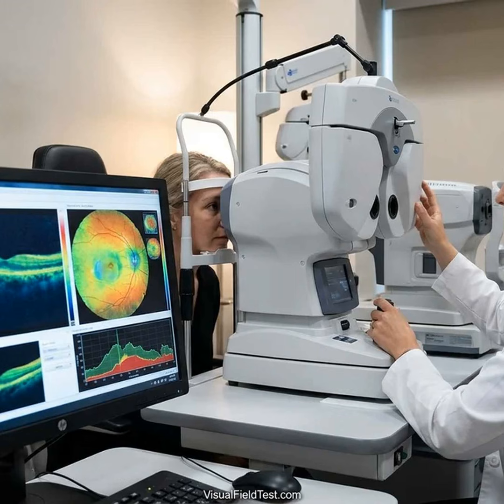One key tool is Optical Coherence Tomography, OCT. OCT is a non-invasive imaging scan that uses light to make cross-section pictures of the retina, the light-sensing layer of the eye. It can measure the thickness of important retinal layers and the optic nerve head. By tracking these measurements over time, OCT helps doctors see damage to nerve fibers before it shows up on vision tests. However, OCT is not perfect or standalone. It's one piece of the puzzle in glaucoma care.